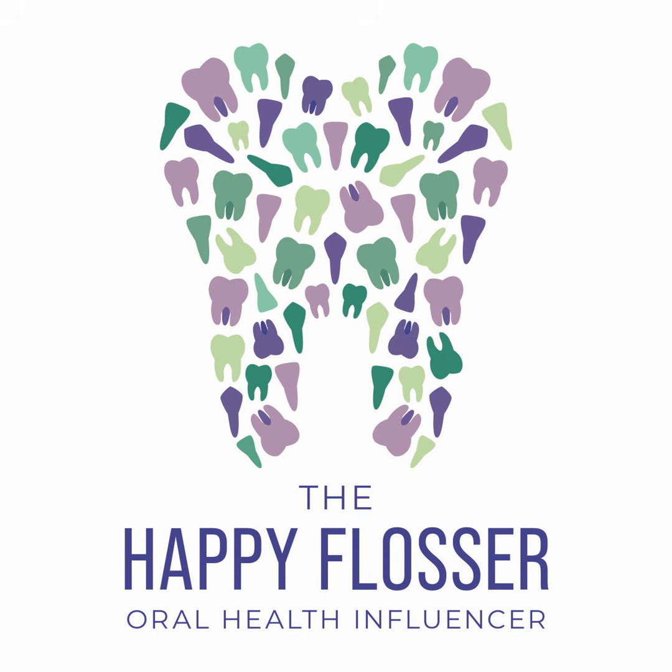The idea is to get images of all of the apices of all of the teeth. And the placement of each of the films is taught and designed in a way that allows you to achieve that. When you take radiology, you will learn the positioning of where these film placements are. If you are taking 6 anterior images, the central image is centered between the incisors, and the subsequent images are centered on the canines.